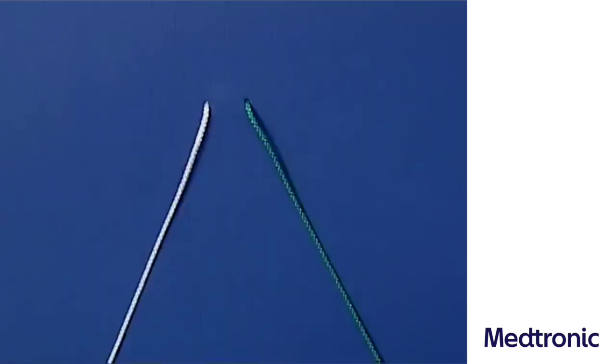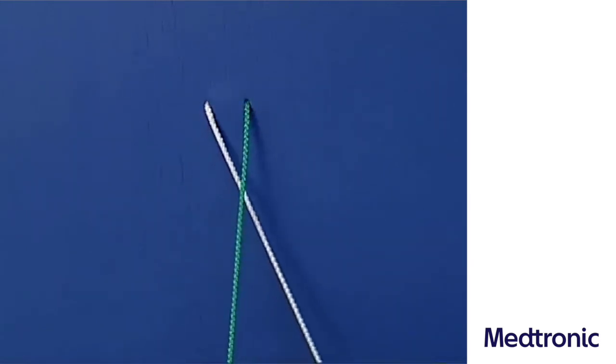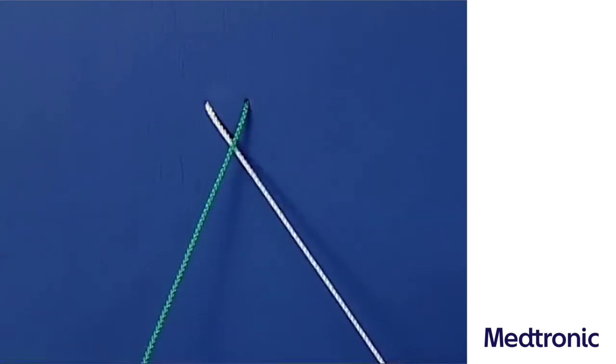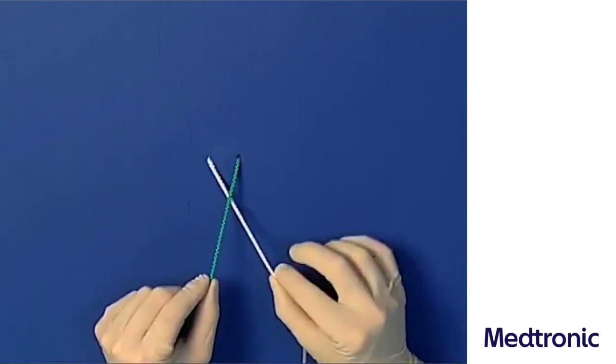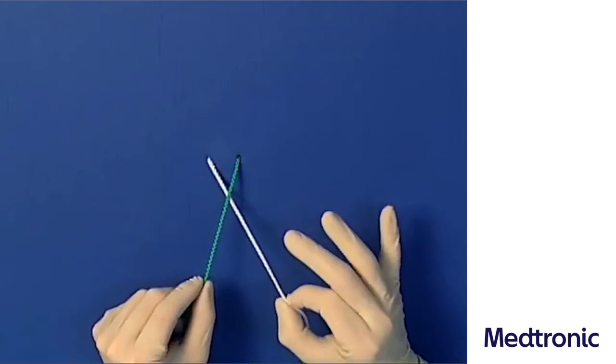The one-handed knot: the suture ends are held crosswise. In this example, the right hand is the knotting hand and the left hand holds the pulling thread. The tying thread crosses underneath the pulling thread. The left suture end is held between the thumb and index finger of the right hand and led around the ulnar margin of the right fifth finger.